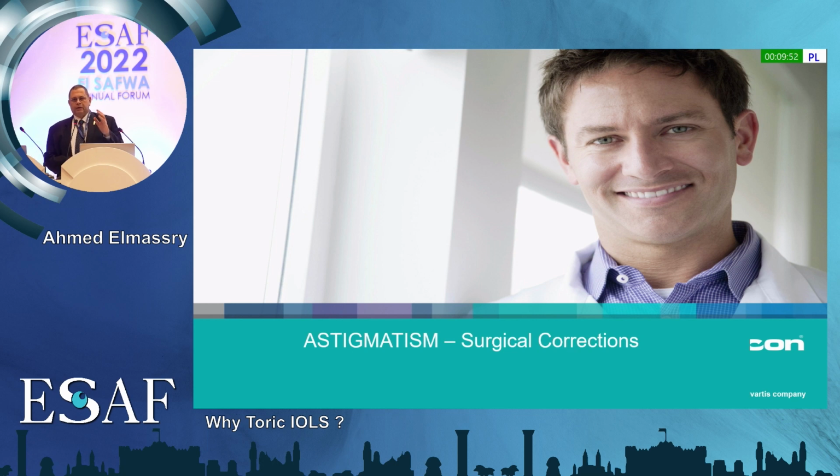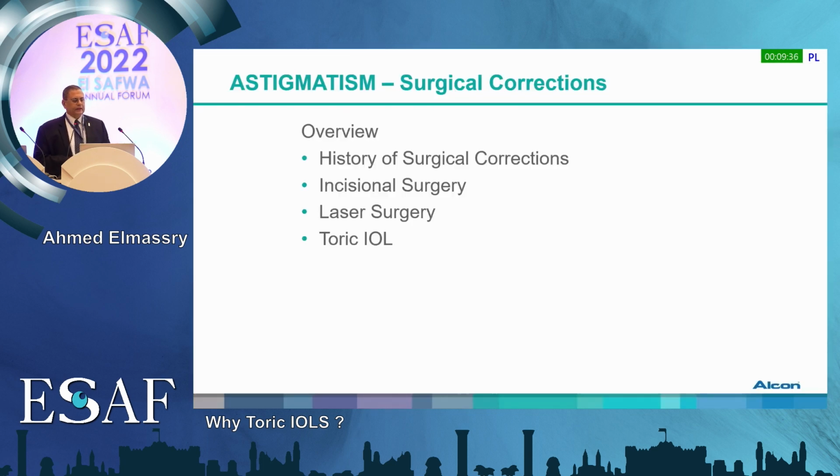Because when you have a perfect surgery with just half a diopter of astigmatism after toric IOL, the patient says, why do I still have half a diopter? But when you tell him before the surgery that up to 1 diopter is accepted after the toric IOL, and this, of course, Dr. Ala Izzawi is going to talk about in detail. Again, how to treat the astigmatism.